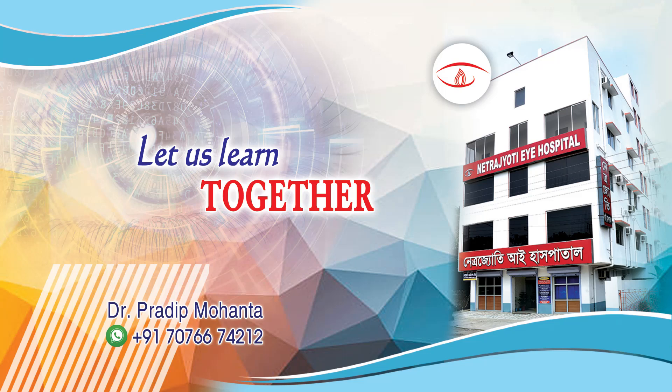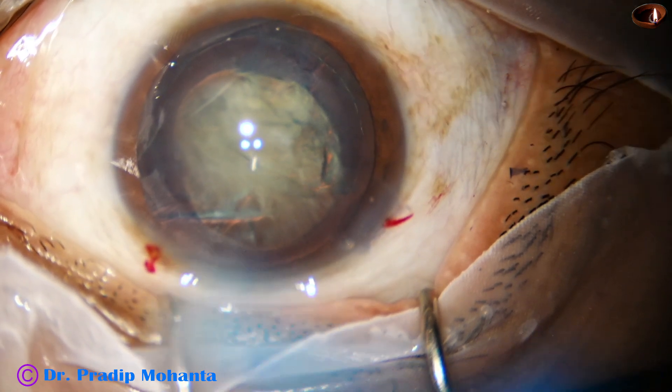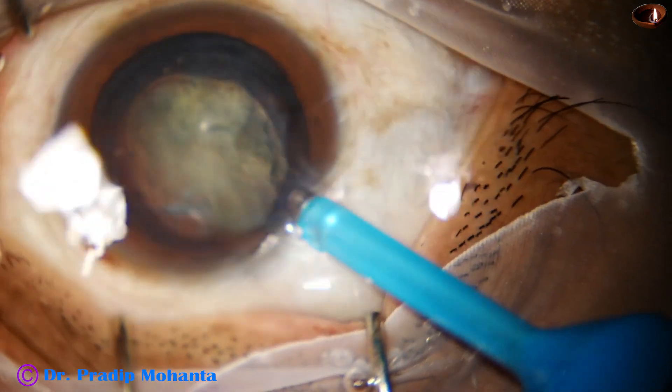Friends, in this video we will see direct chop by my fellow. By this time the main incision has been made, capsulorexis has been done, hydrodissection has been done, and the anterior chamber has been filled up with visco.